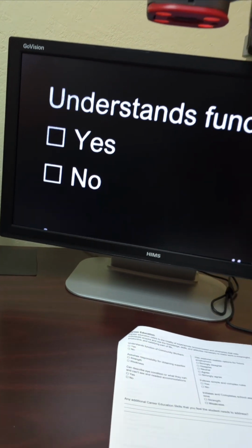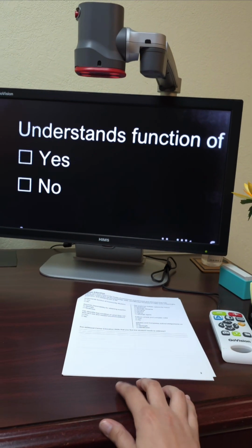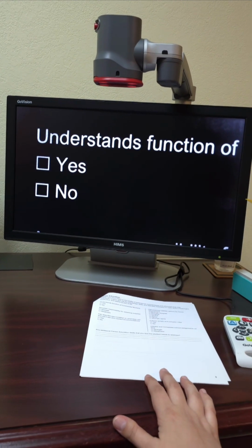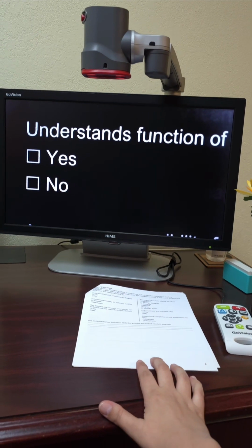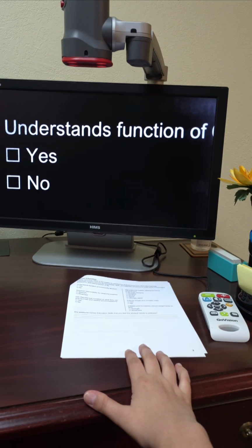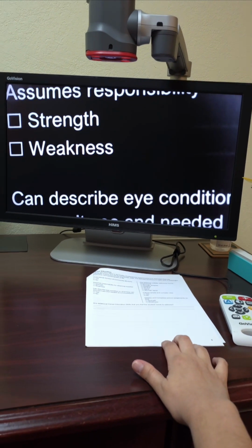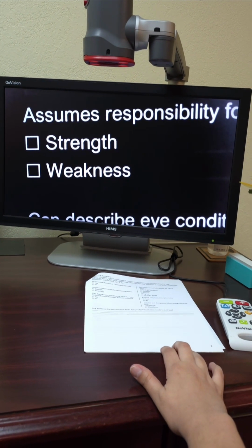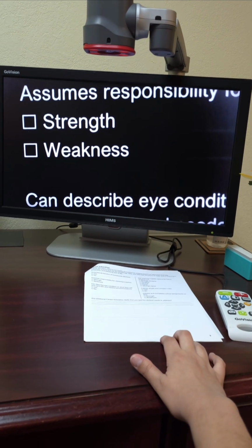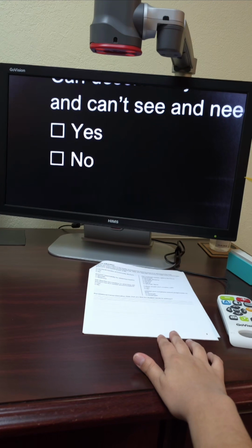I'm gonna push back here so you can see more of the screen and what is actually showing on the screen. I can't read it from back here, but I know you can. So here then I would look at whatever that question is and then use my pen to check the boxes, and then I would push my paper up and read the next one and check the box, push my paper up and read the next one, and so on and so forth.